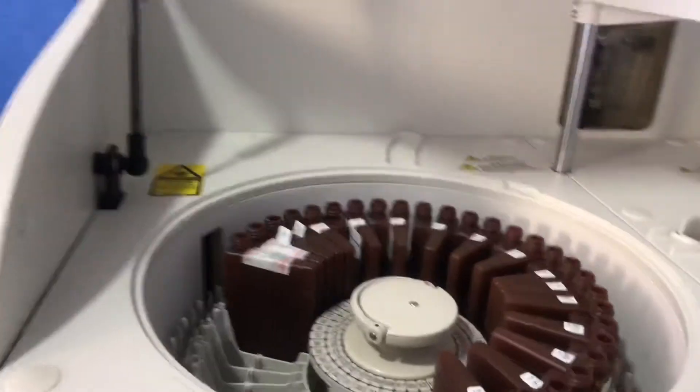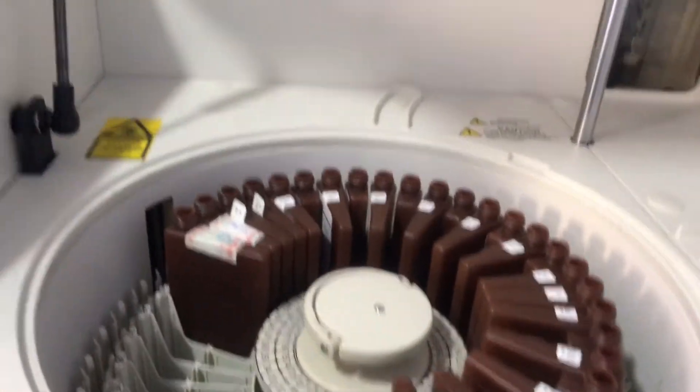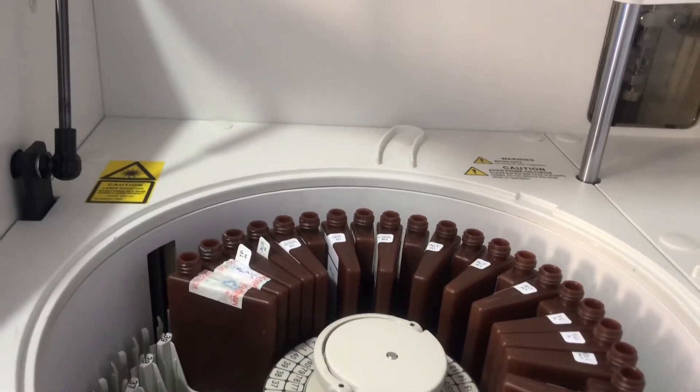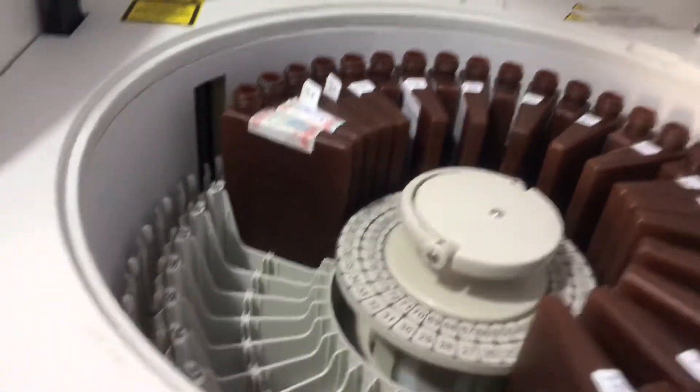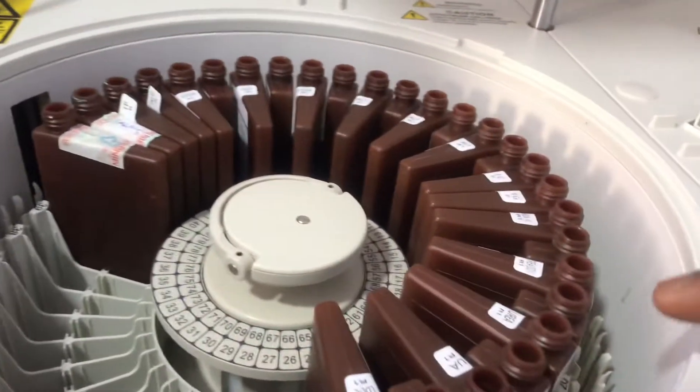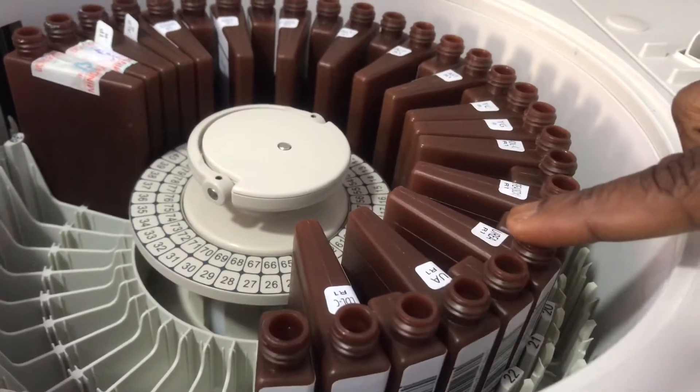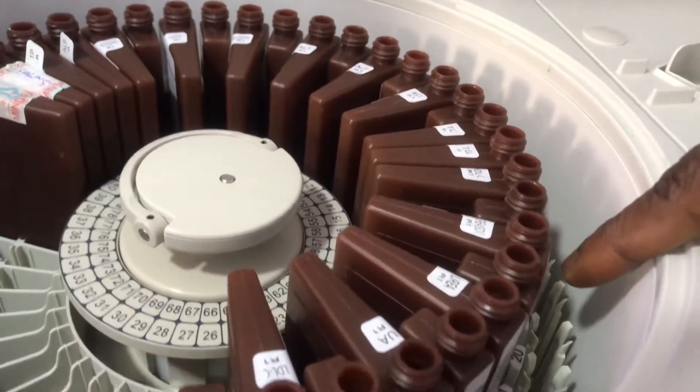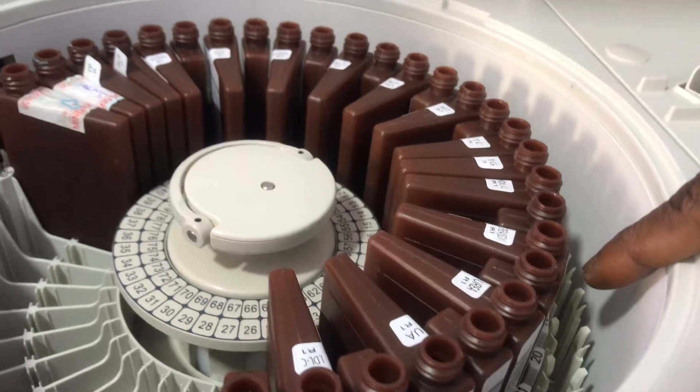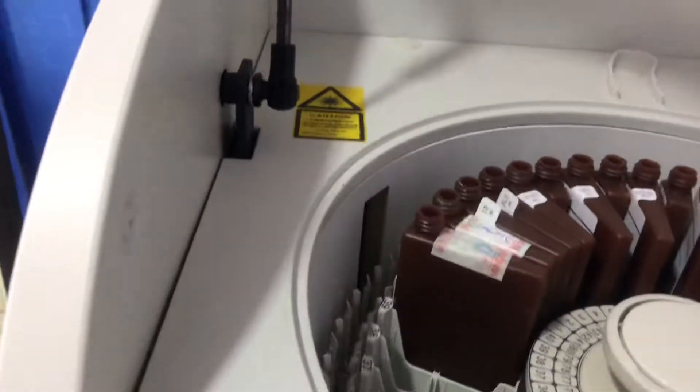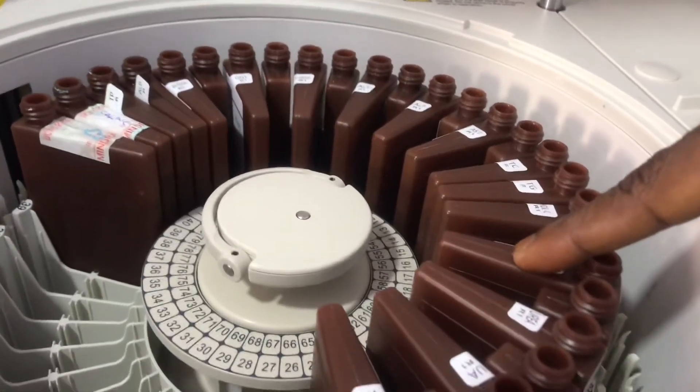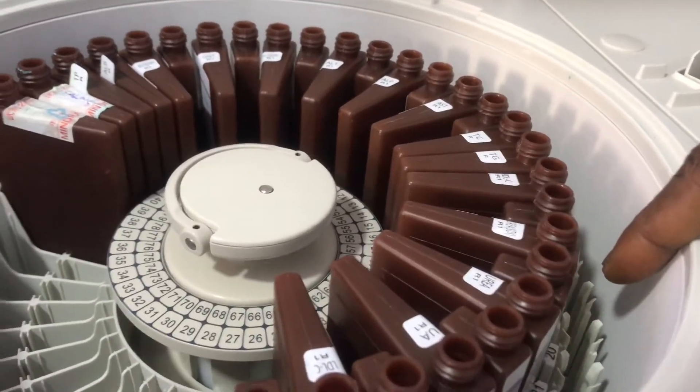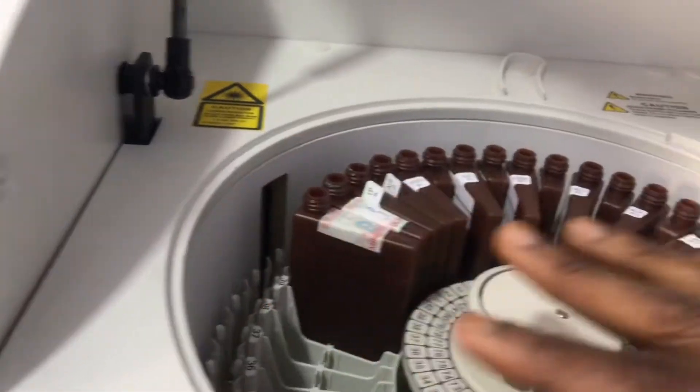So when it's open, this is how it looks like. This is called the sample and reagent carousel. Basically it has a turntable that hosts the reagent, so these are reagents and this is where you place your sample in a tube.